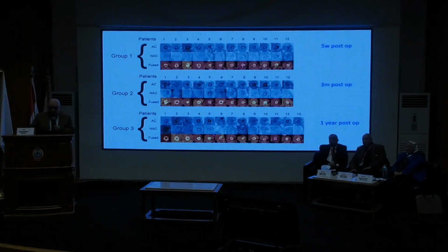This is a study that was done to show the activity of the FDG related to prosthetic valve after operation in patients without infective endocarditis.